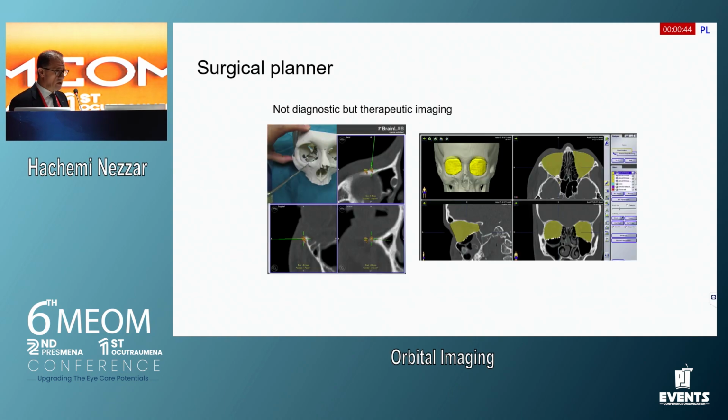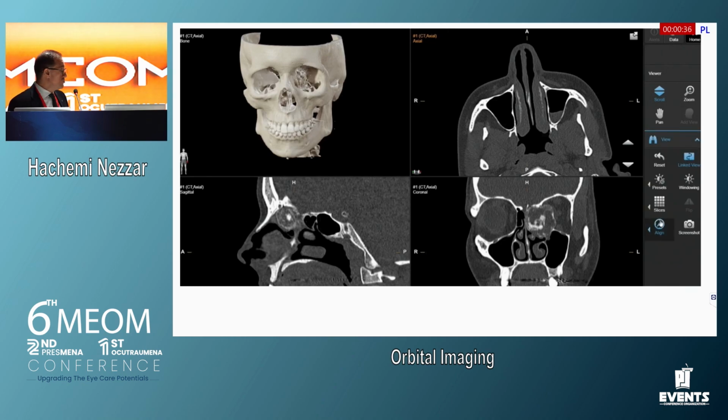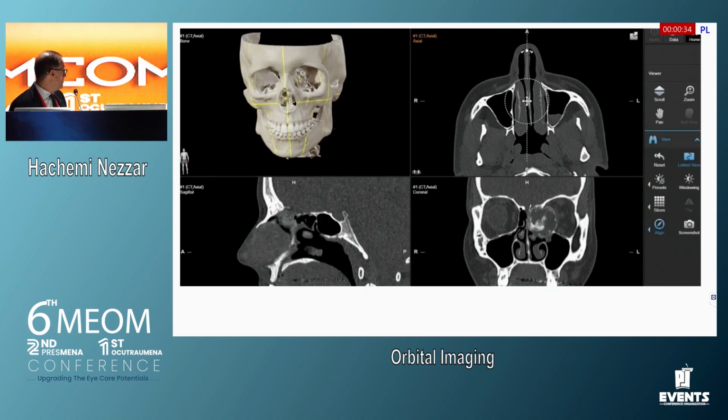We can utilize the imaging for planning a surgery. As in this case, you can evaluate the volume, what you want to remove, how much, and also in this case, you can do a surgical plan before.